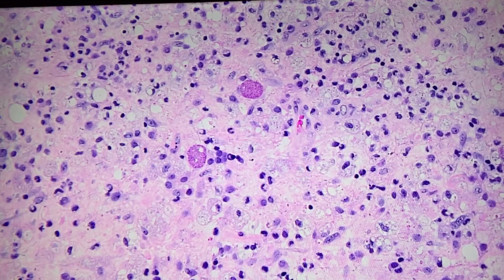3. Right? So once you know that morphology, see how powerful that is. You just need to find the organism. And just think of the background lymphoplasmacytic infiltrate and remember this morphology for toxo. Everybody good with that? Yep. All right. 2 more cases and we're done.